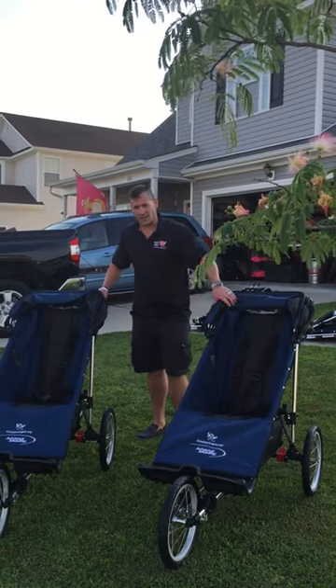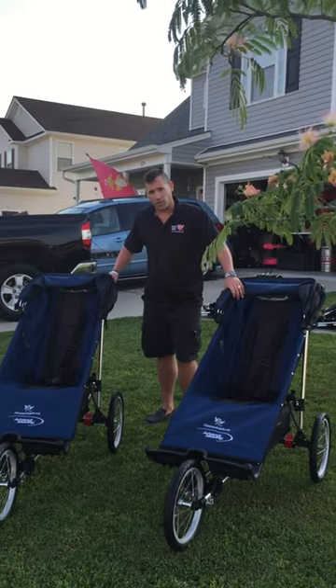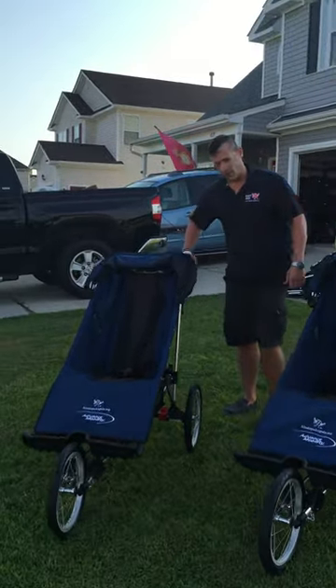Hey everybody! I've been getting a lot of questions about how to take these freedom chairs apart and put them back together. So in the next 90 seconds or less, we're going to take one apart for you — come on over and we'll show you how we do it.